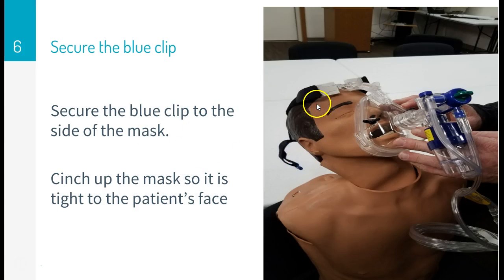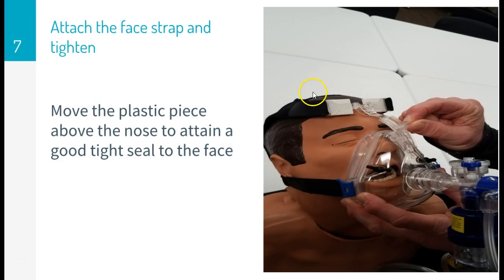the person's face. You can see the blue clip right here. We'll clip in that little notch to the face mask. Cinch it up nice and tight, so it's going to be a nice tight seal to the patient's face, and adjust the head cap as well in this case. You can tighten that face strap.